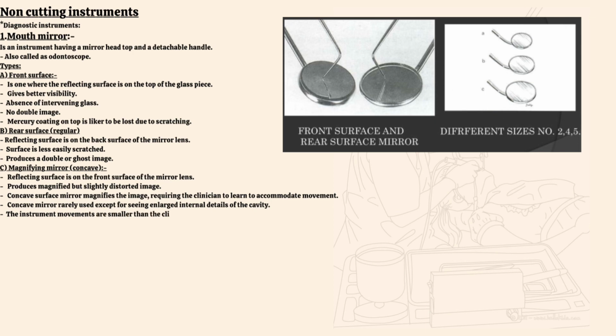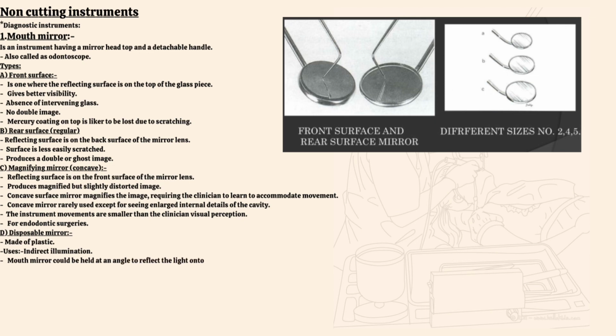The instrument movements are smaller than the clinician's visual perception, for endodontic surgeries. D. Disposable mirror, made of plastic. Uses: indirect illumination. The mouth mirror could be held at an angle to reflect the light onto the working area.